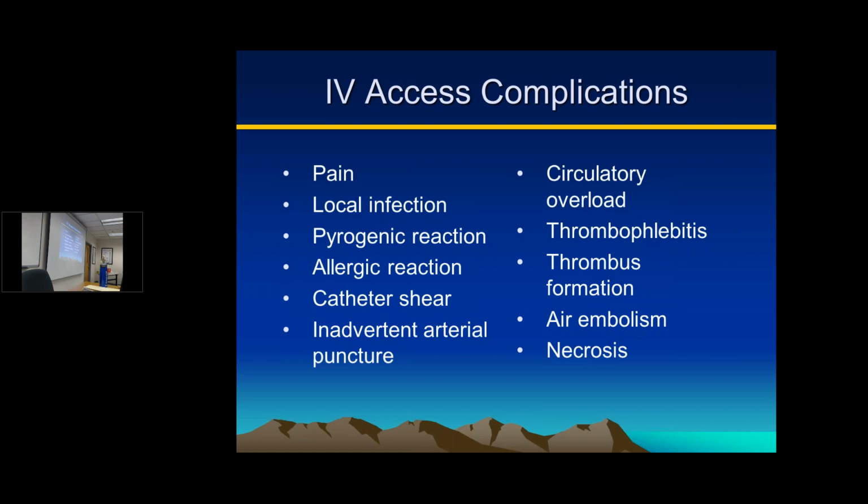Nevertheless, you don't want to be the person that says, "Oops, I got flushed out along the way. Look what I did," right? So getting real crazy about getting rid of all these bubbles is good practice. Is it needed? Probably not. Folks can do very, very well with some small bubbles along the way. So you do your best practice in trying to get rid of as much as possible, but don't spend the next 5 minutes trying to get rid of all of it. Exactly.